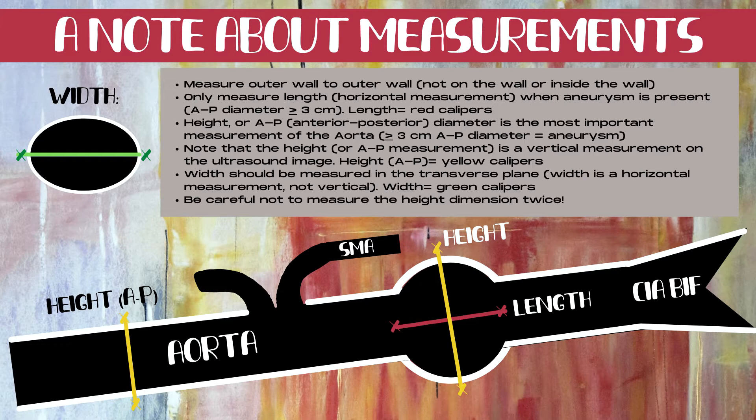The first set of yellow calipers in the proximal aorta demonstrates a normal aorta measurement when the aorta is of normal caliber. It's really important that the calipers are placed 90 degrees perpendicular to the lie of the aorta. When measuring an aneurysm, as shown more distally in this image, the calipers are also placed outer wall to outer wall, and that AP or height dimension is measured at its greatest diameter, 90 degrees perpendicular to the lie of the aorta itself.